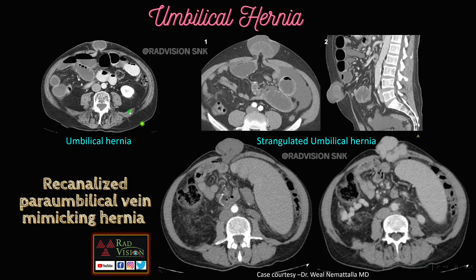Next, commonly we see small bowel loops herniating through the umbilical region — this is umbilical hernia with dilatation of bowel loops. Here also there is herniation of the bowel loop through the umbilical defect, but the enhancement of the herniated bowel loop is not similar to the bowel loops in the abdomen, and there is a narrow pedicle with crowding of vessels — this was a case of strangulated umbilical hernia. Here also there is a soft tissue lesion in the abdominal wall mimicking hernia, but after contrast the enhancement is similar to multiple collaterals with splenomegaly — this was portal hypertension with a recanalized paraumbilical vein mimicking umbilical hernia.